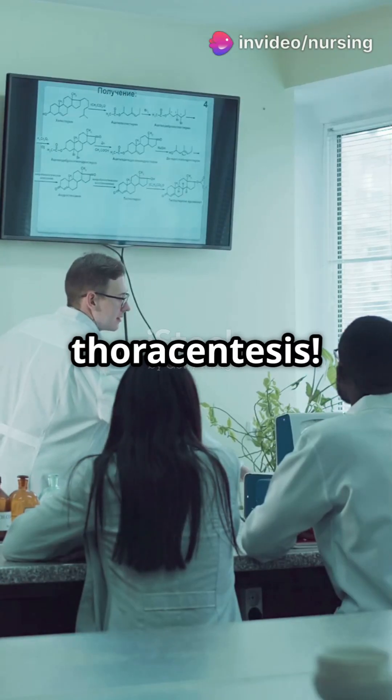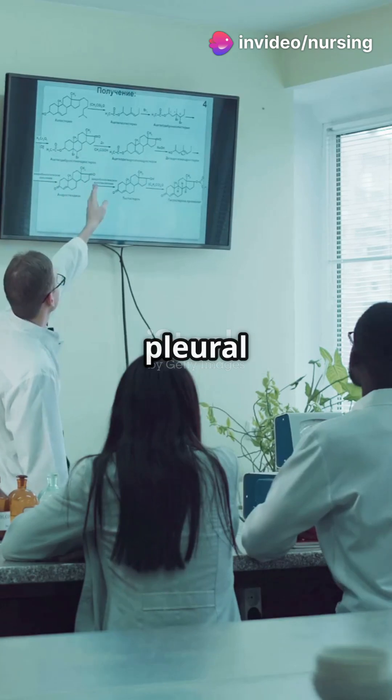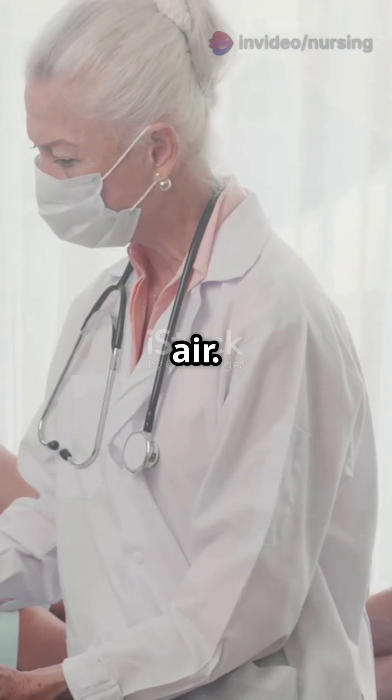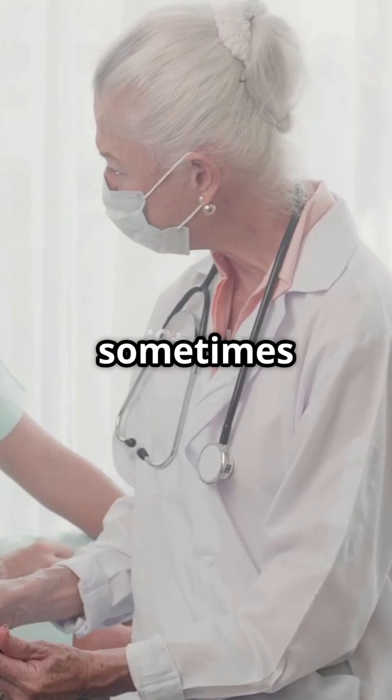Nursing students, this is your quick guide to thoracentesis. Thoracentesis involves inserting a needle into the pleural space to remove fluid or air. It's used for conditions like pleural effusion, empyema, and sometimes pneumothorax.